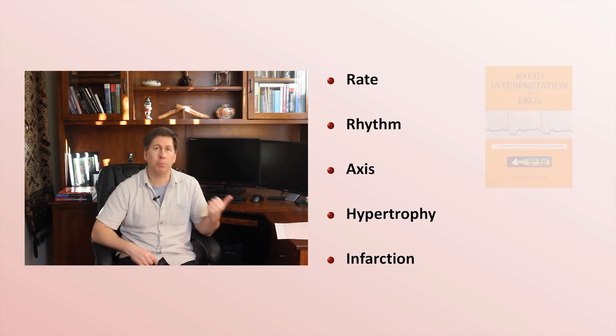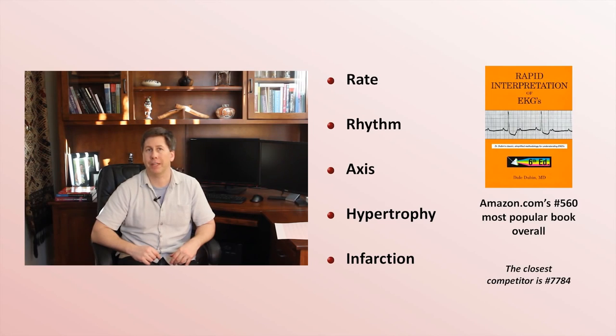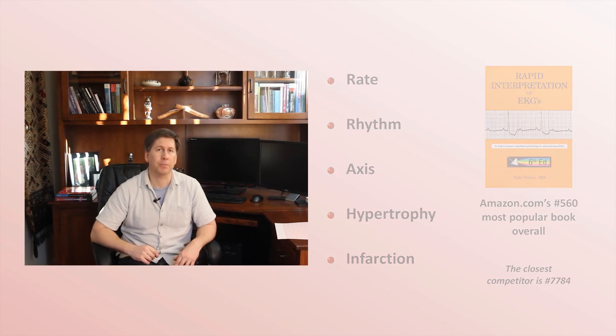It's on account of this book, which is by far the most popular book in the world on EKG interpretation. Unfortunately, despite its popularity, it's also not very good, and its general approach frames and organizes the interpretation in a way which is illogical and encourages bad habits. Therefore, I recommend something different.